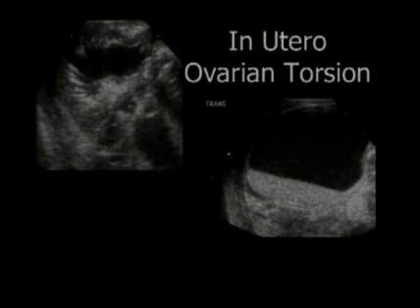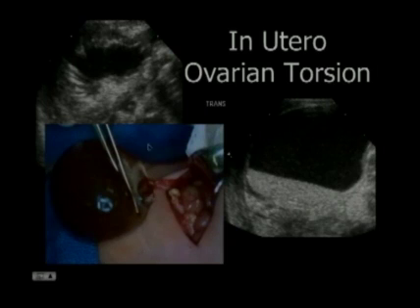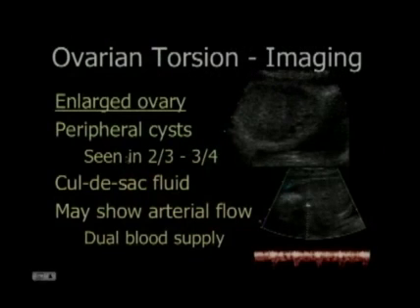This is an in utero torsion. A child with a cystic mass seen in utero was born, and we see this complex fluid-filled cyst with a debris fluid level. And down at the bottom there was this kind of swirling pattern down toward a central pedicle at the base of this mass. And at surgery, I think you can see here is the pedicle, the torsed necrotic ovary, and we were seeing this sort of swirling of the base as it came down into this twist. So that's been described. I haven't seen this frequently, but again, it's something you can look for to help narrow your diagnosis when you're doing scans in these kids.